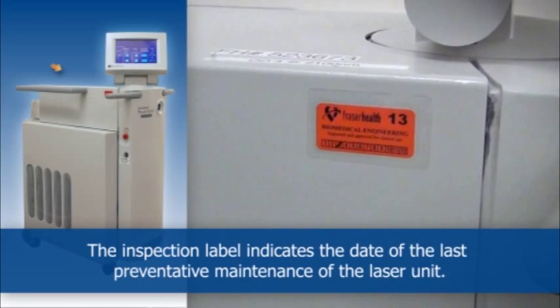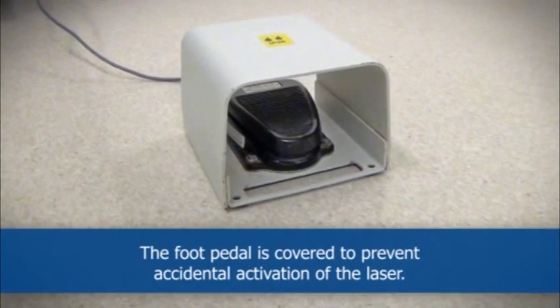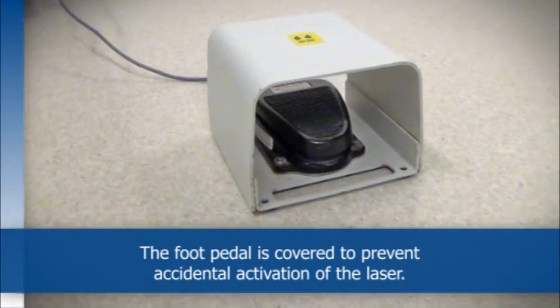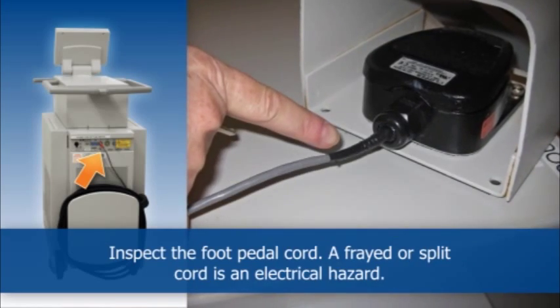The inspection label indicates the date of the last preventative maintenance of the laser unit. The foot pedal is covered to prevent accidental activation of the laser. Inspect the foot pedal cord — a frayed or split cord is an electrical hazard.